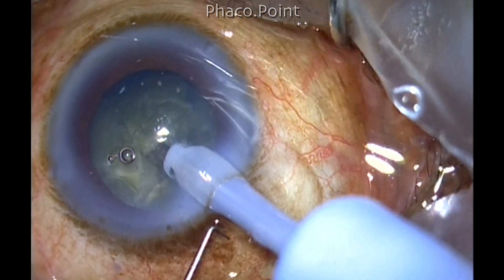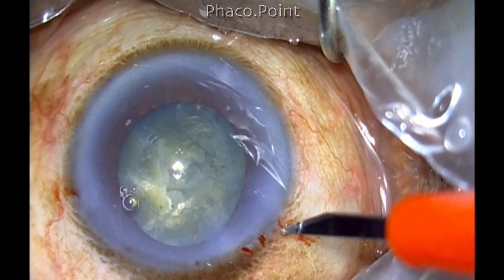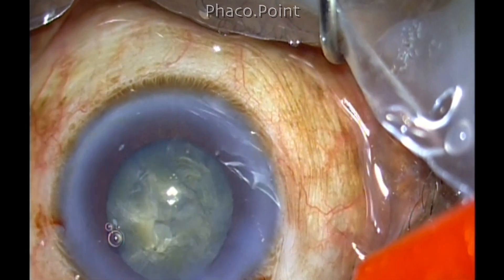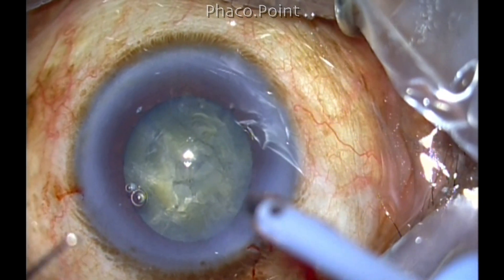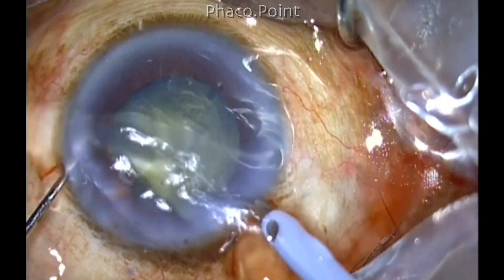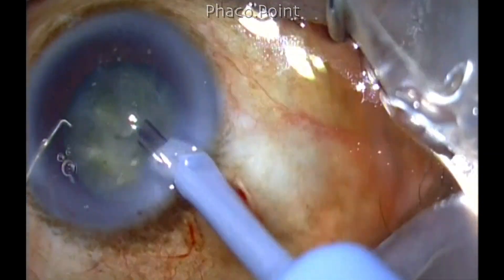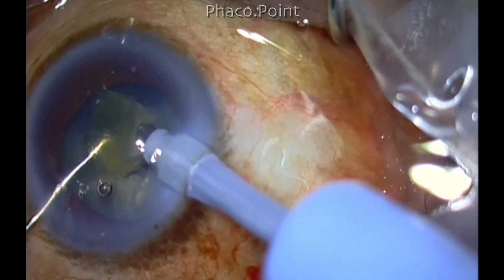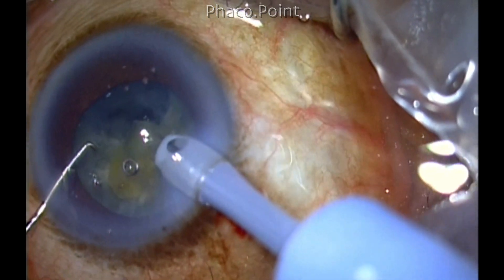I'm not making just four quadrants. Because of the ballooning of the conjunctiva, I come out and make a small nick in the conjunctiva to prevent this ballooning from progressing during the phaco emulsification. At this point, because I've finished cracking up the nucleus, I also switch from a chopper to a Sinski hook.